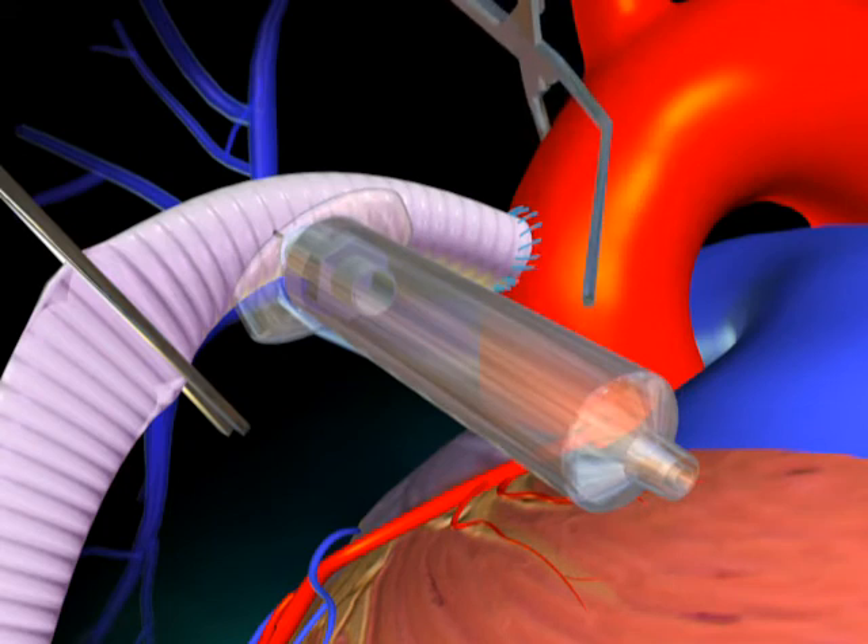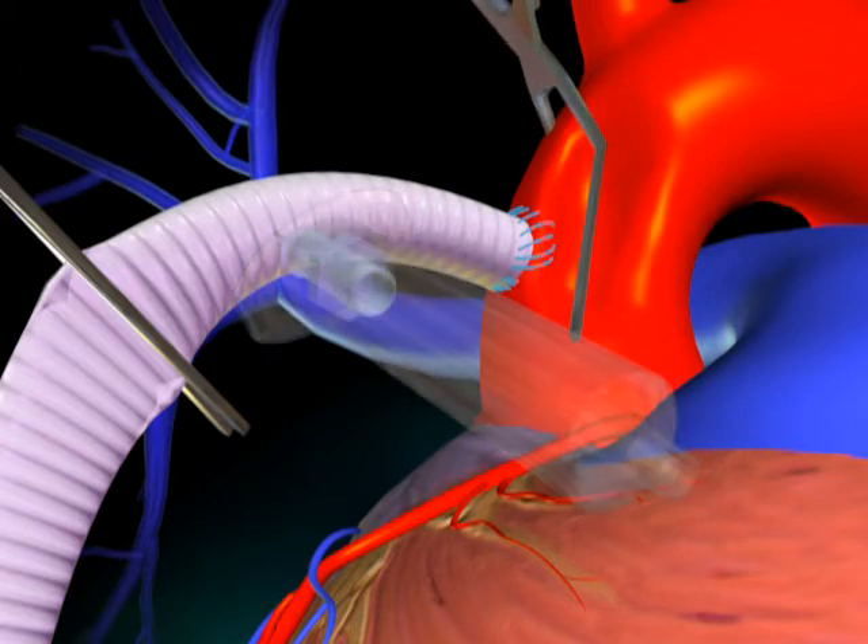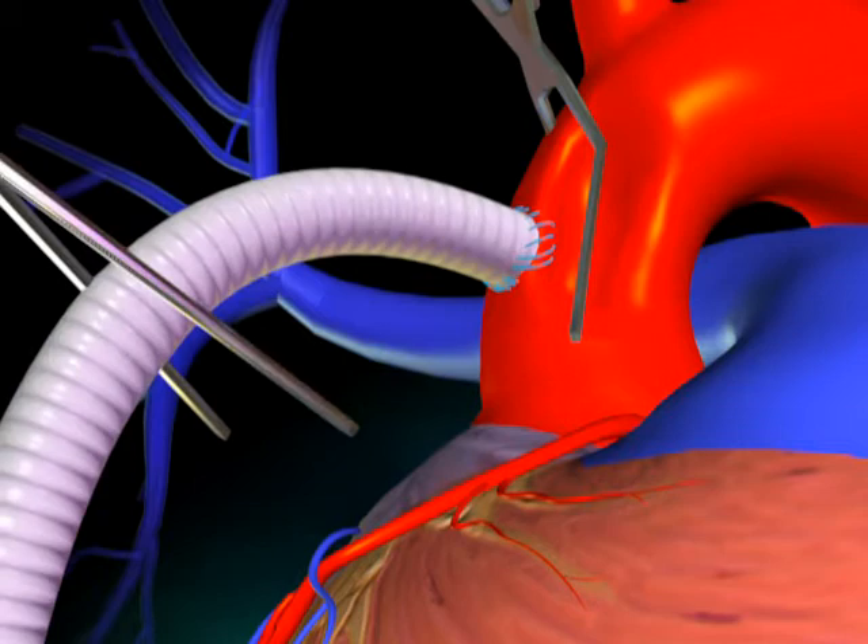Temporarily release the aortic partial occluding clamp to complete the de-airing. Re-clamp the aorta, remove the needle, and over-sew the needle hole.